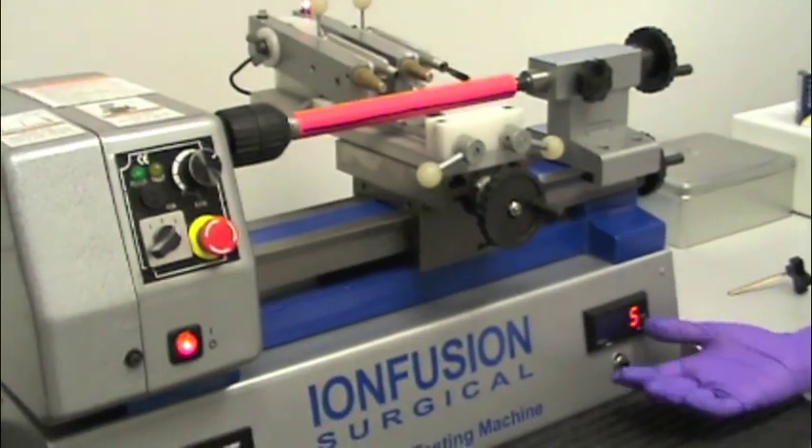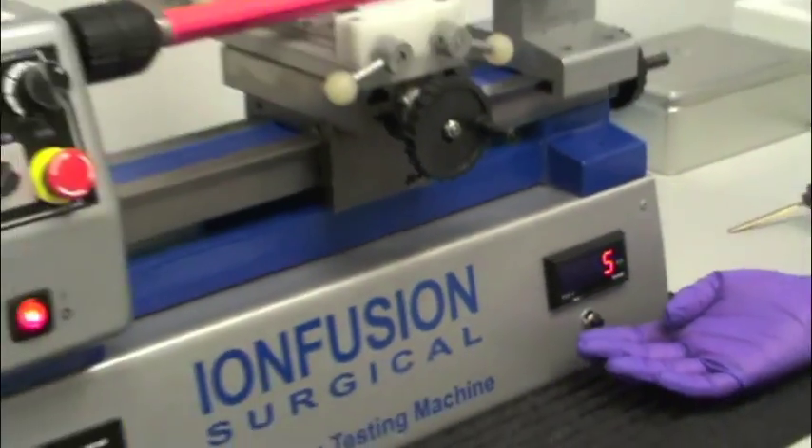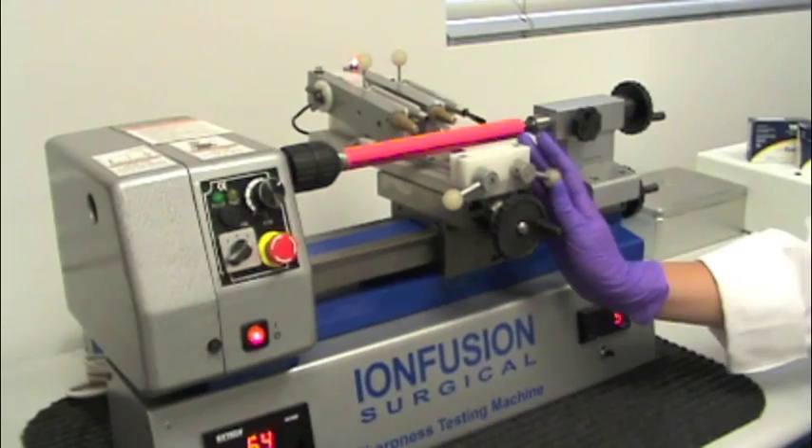As you can see, it took the Ion Fusion blade five revolutions to cut through the test media. I will now remove the Ion Fusion scalpel blade and continue the test.